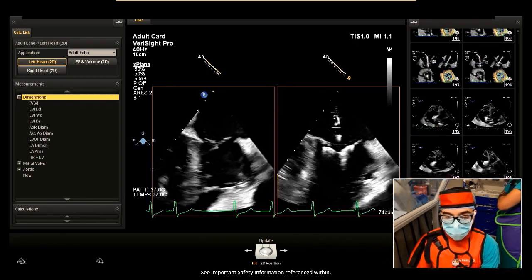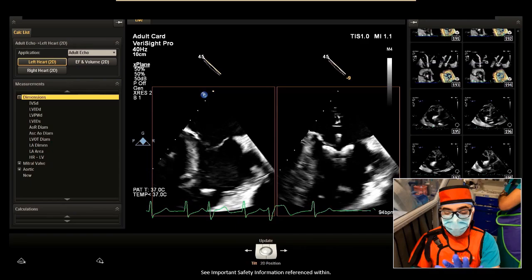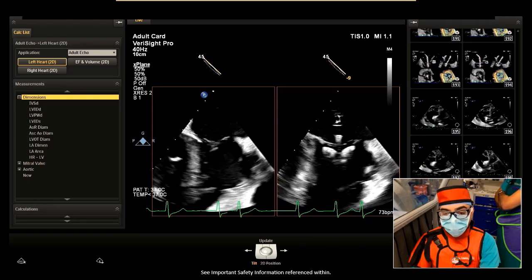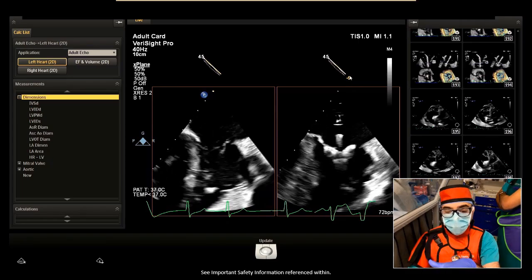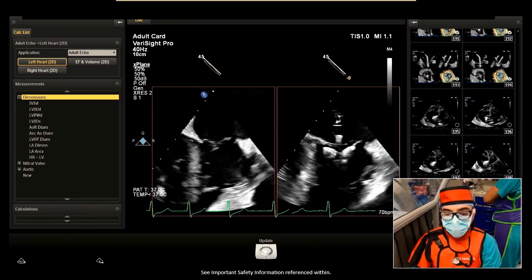And there's a feature called tilt elevation. What I'm really doing at 45 degrees is fanning either away from the aorta or towards the aorta. I knew we were maybe a little bit more aortic relative to the clip, so I just fanned here. You can see this right image says -9, so I added 9 degrees of tilt away from our actual location, and I can see the arms very well.